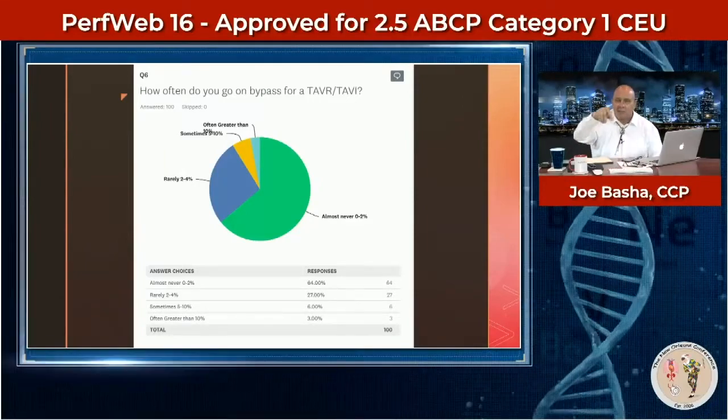So let's go back and bring Nate back in, because these are some really good points. So Nate, based on that information, when you look at the preliminary comments that I made that were written, where they said that they put every patient who has a problem on some type of support to see if they can correct the problem. And this was something I feel was an issue some years ago when we discussed this. We would say, well, if the patient isn't a surgical candidate, now in their case, they said that they had some patients that were not surgical candidates, but they still put them on bypass of whatever form, ECMO or whatever it was, to support them to see if they could correct the problem.